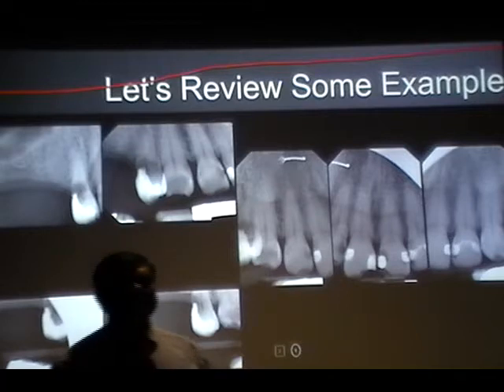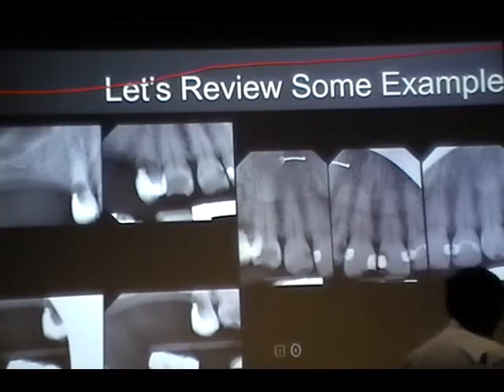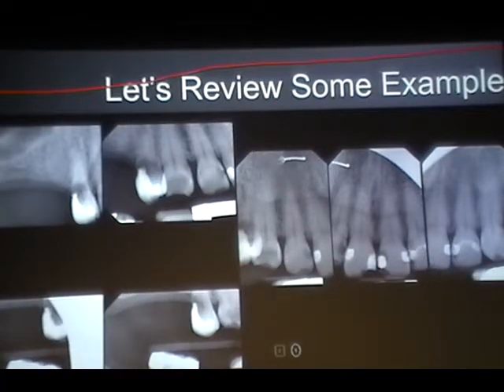This one, the angulation, there's not an open contact, but you have a good open contact between the central incisor and the lateral incisor. How many of you agree with that particular statement? Or how many disagree? How many agree that there is no contact?